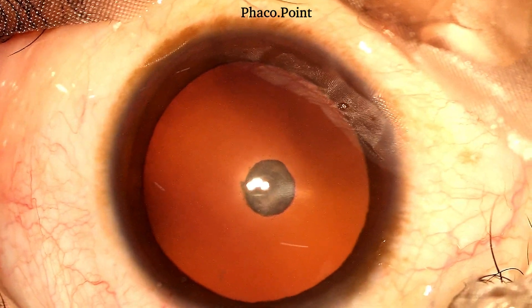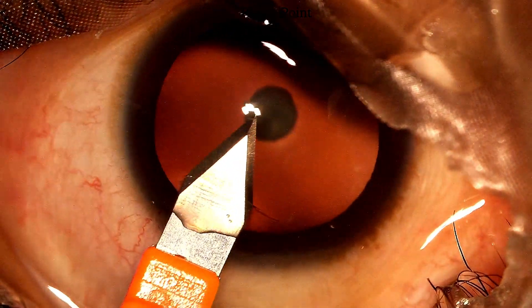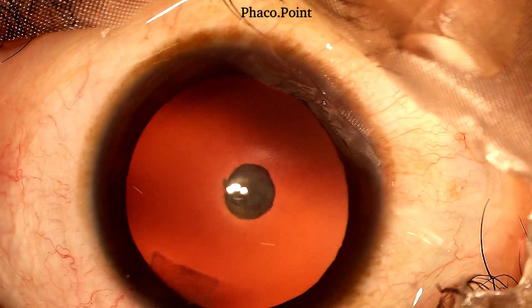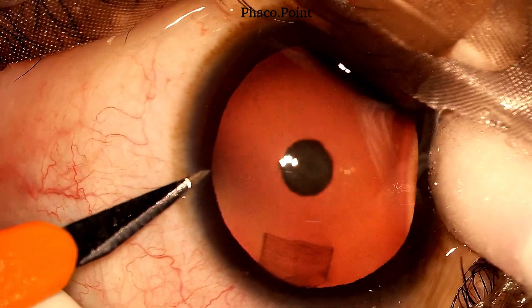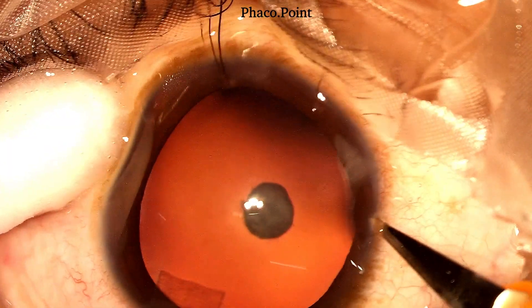Let's start with the incisions. When I create the main 2.8 millimeter tunnel or the paracentesis incisions, I make sure that I do not lose any aqueous during this step. Here I'm able to maintain the chamber perfectly.